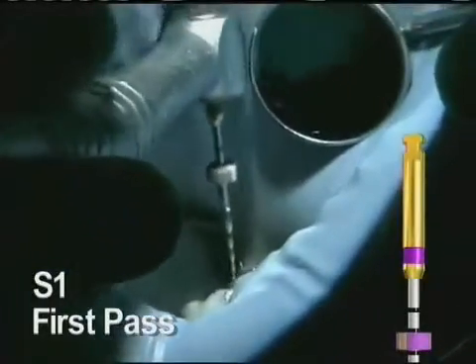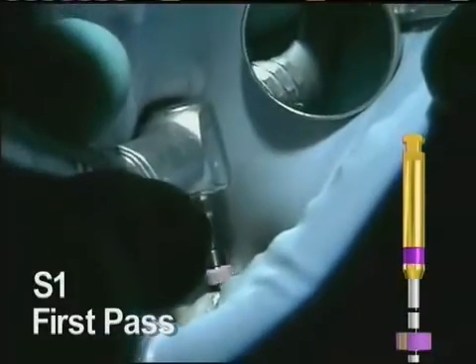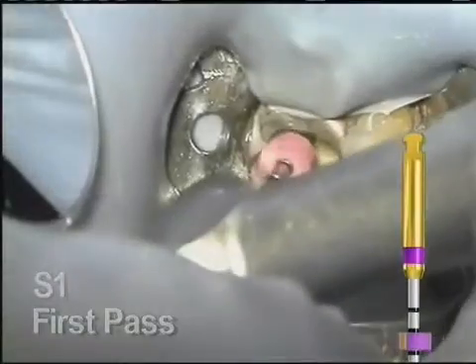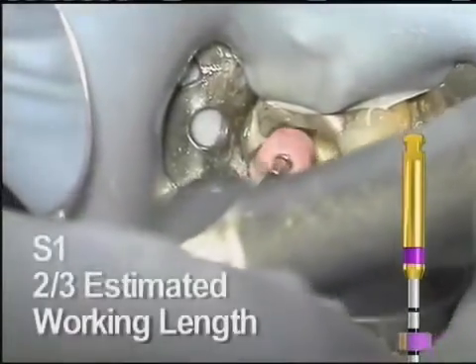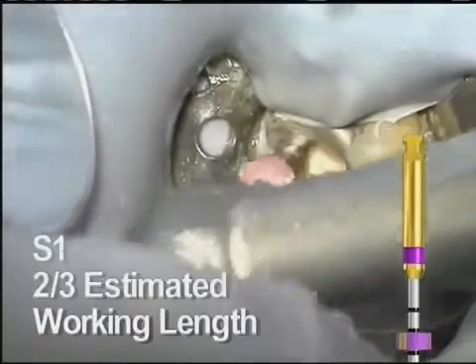Coronal shaping begins with the S1. This is used at 300 RPM and can be worked in a brushing manner to move the access away from the furcation. The S1 is taken no further than the depth of the 10 and 15 hand files we worked with earlier. It may take more than one pass to get to that depth.